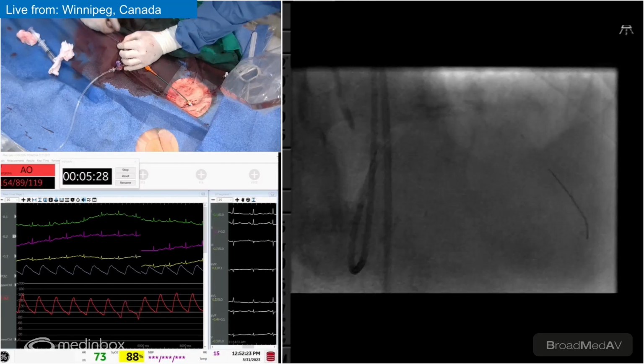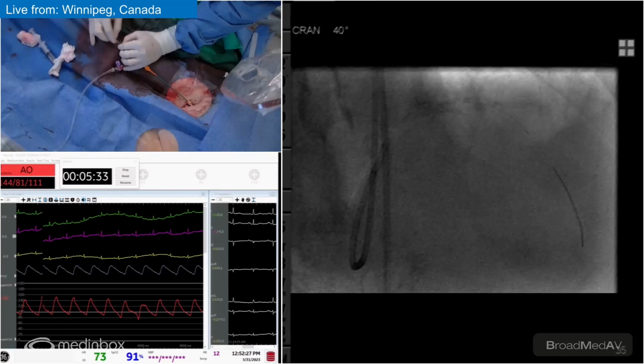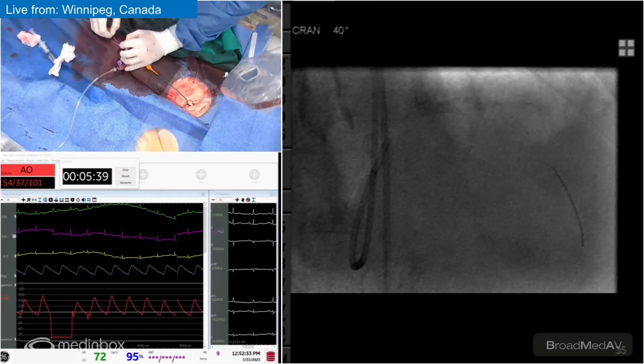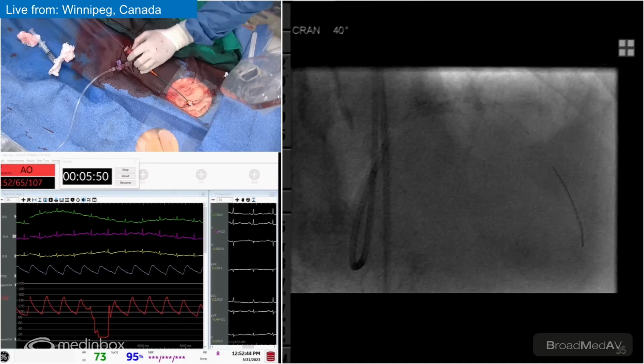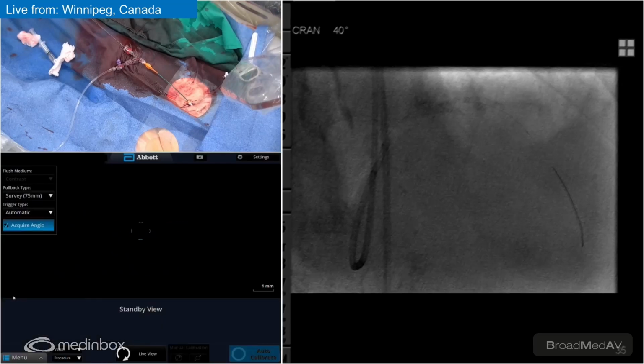I get the guideliner in. I'm going to lead with the front end of the OCT. I think we got to get an OCT. This catheter looks pretty buckled here. We can look at the wire go. Can we get another OCT? The tip of it, this one is. What do you think? Yeah, I think another one. Let's get another OCT, please. Yeah, you got it. Want to try this while you're waiting? Yeah, let's do it. Come on, Arjen.